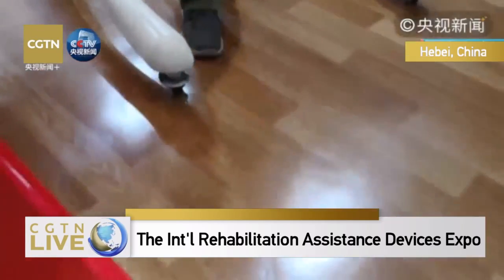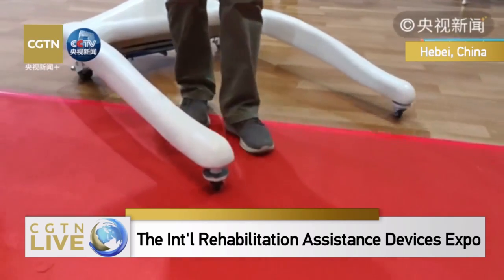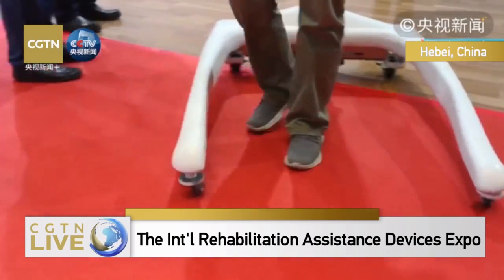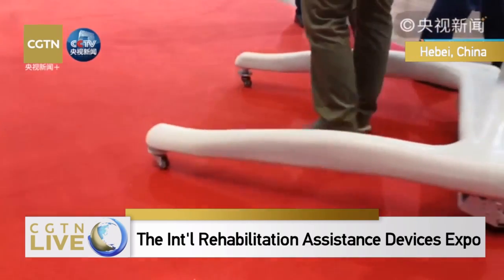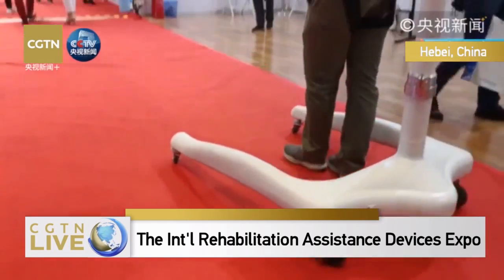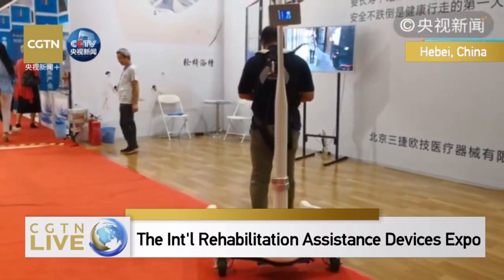You need to be walking like a senior citizen in order to feel the function of this product. I need to be turning slowly.